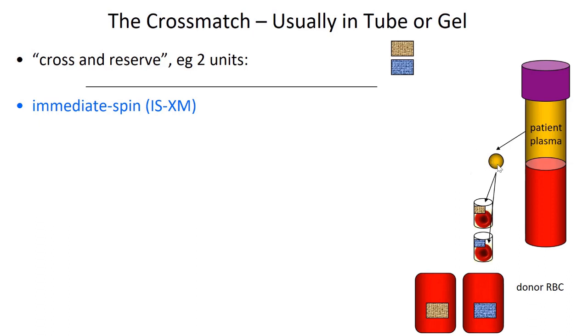And because this is at room temperature, without any additional reagents, this is only identifying IgMs, the most important of which are ABO antibodies, though the odds of catching any such interaction are incredibly low because of policies to have candidate units twice typed, that is ABO confirmed, and with current CSA standards, likewise requiring a patient to have been at least twice typed with concordance in that information before being assigned type-specific blood as opposed to Group O blood in the interim.